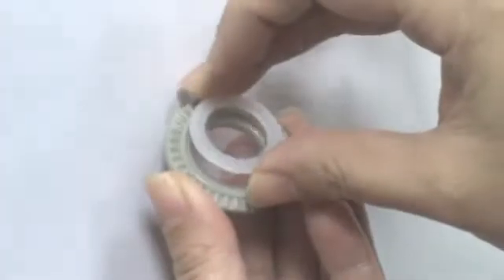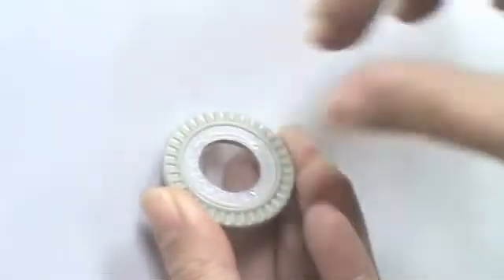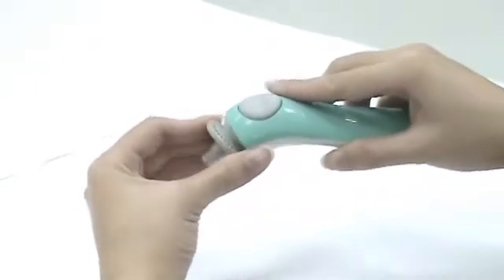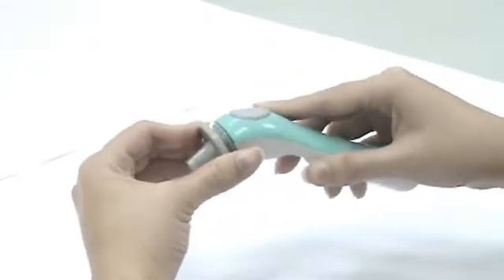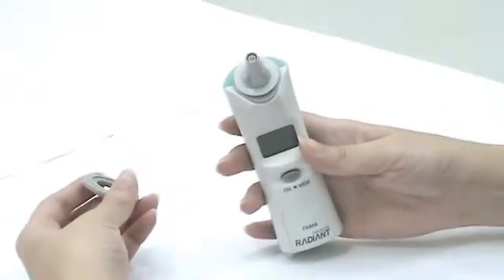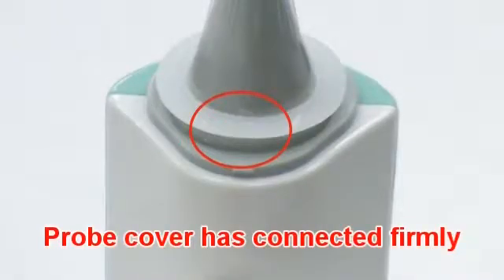Place the probe cover into the connection ring. Align the probe with the center of the probe cover. Insert and push the connection ring until you hear a click sound. The probe cover has connected firmly.